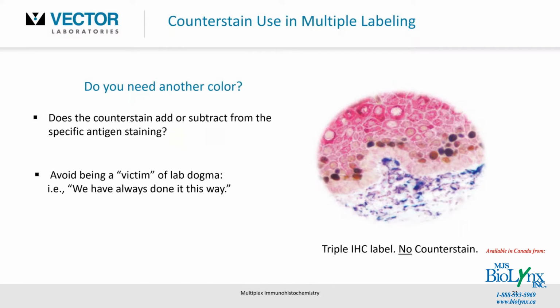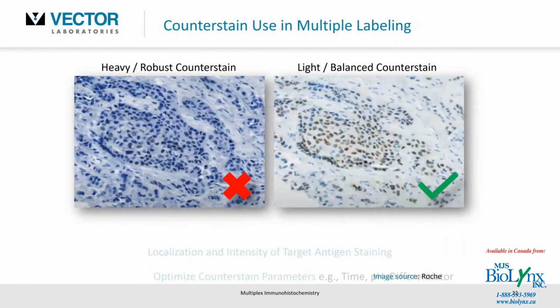So certainly those were shown throughout the presentation. And indeed, the title slide also showed estrogen receptor expression in the nuclei of given breast carcinoma cells as well. So this is certainly something that can be done in multiple antigen labeling, and that should not prevent imaging at all. Either this is going to be done through ImageJ or spectral imaging or some other sort of software you've got. So hopefully that clears up the potential miscommunication about not showing any nuclear staining.